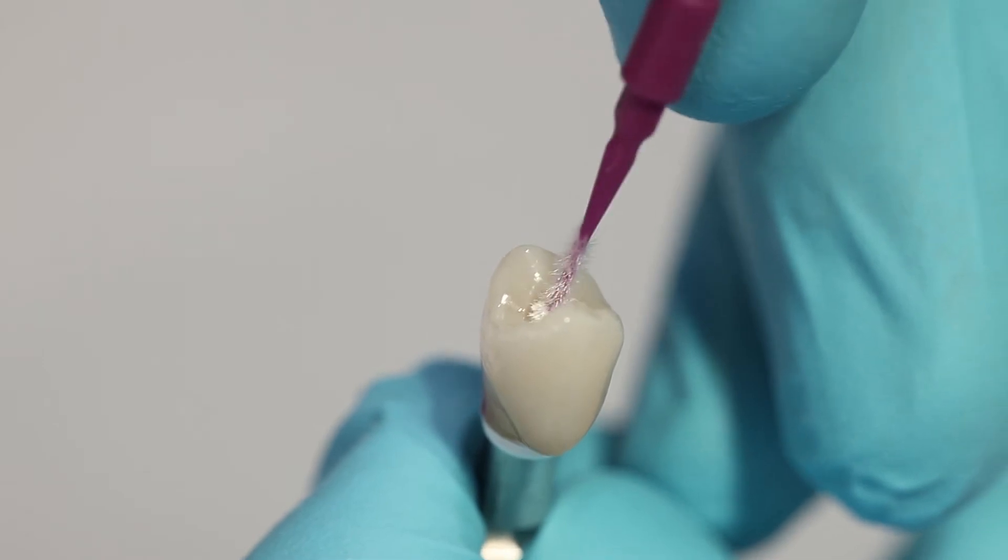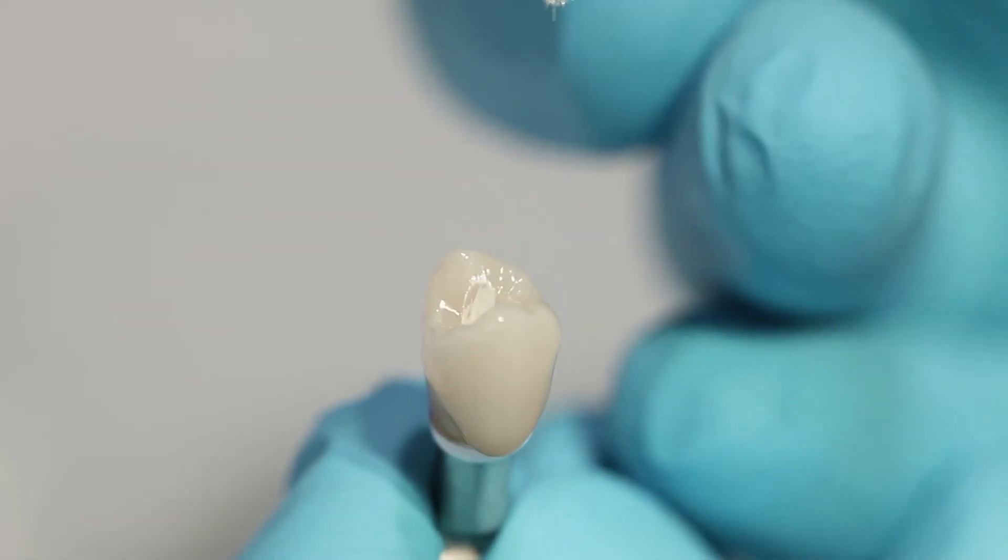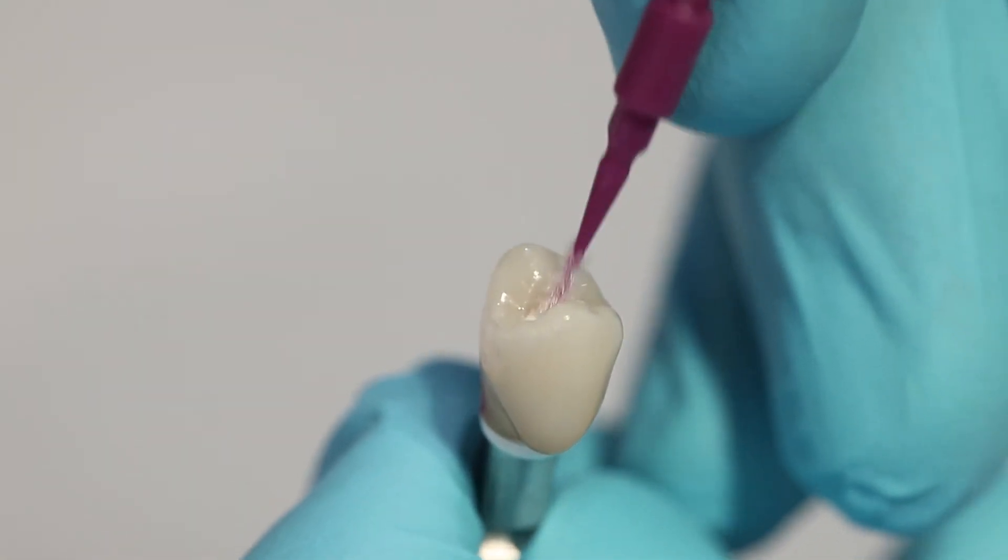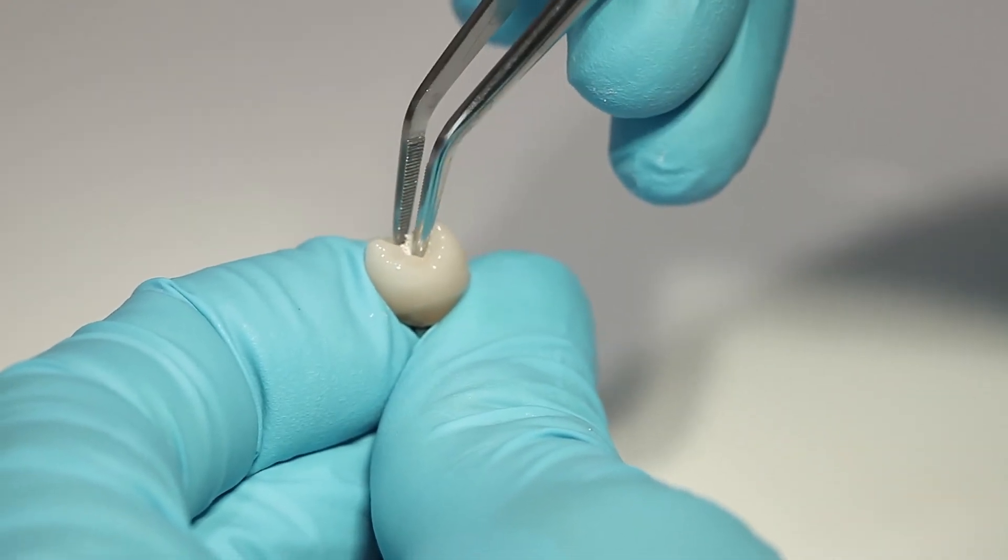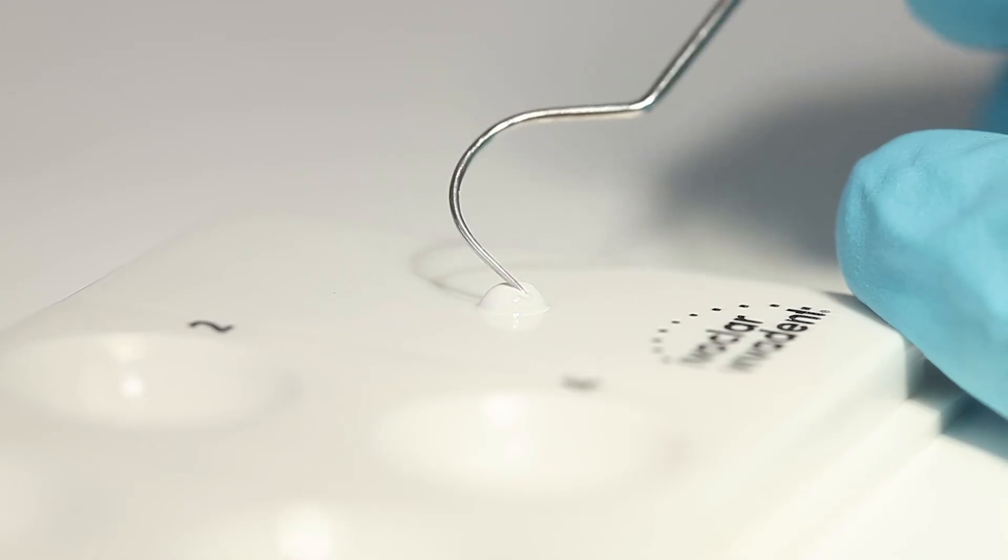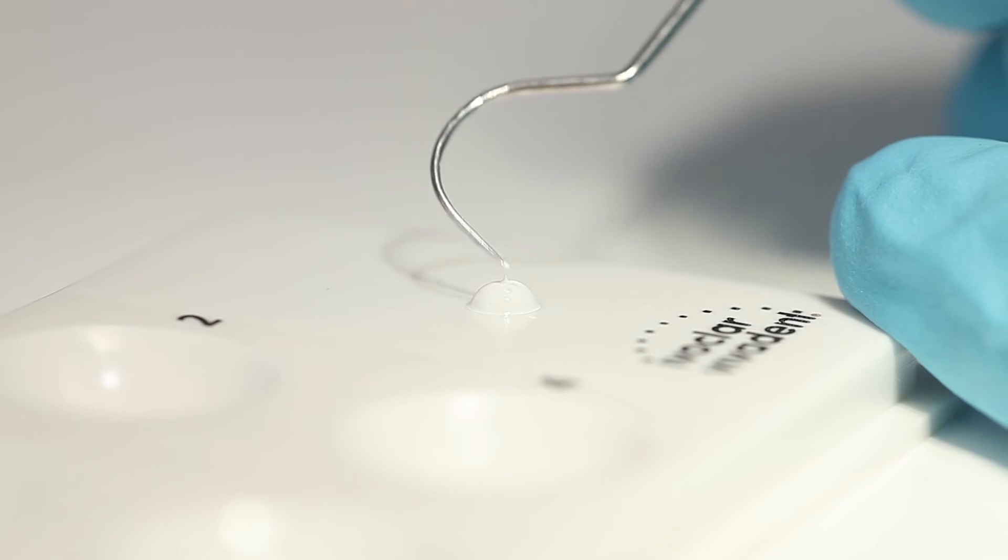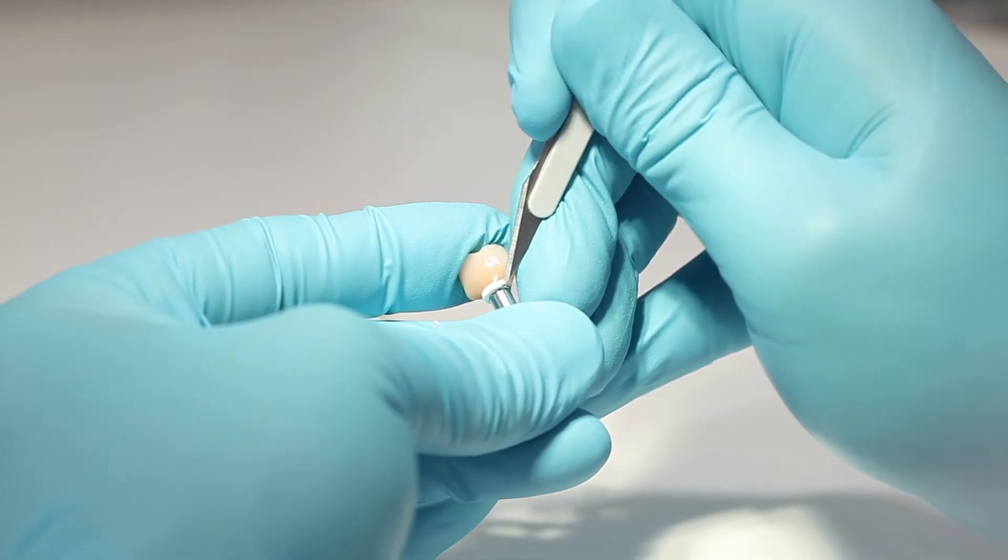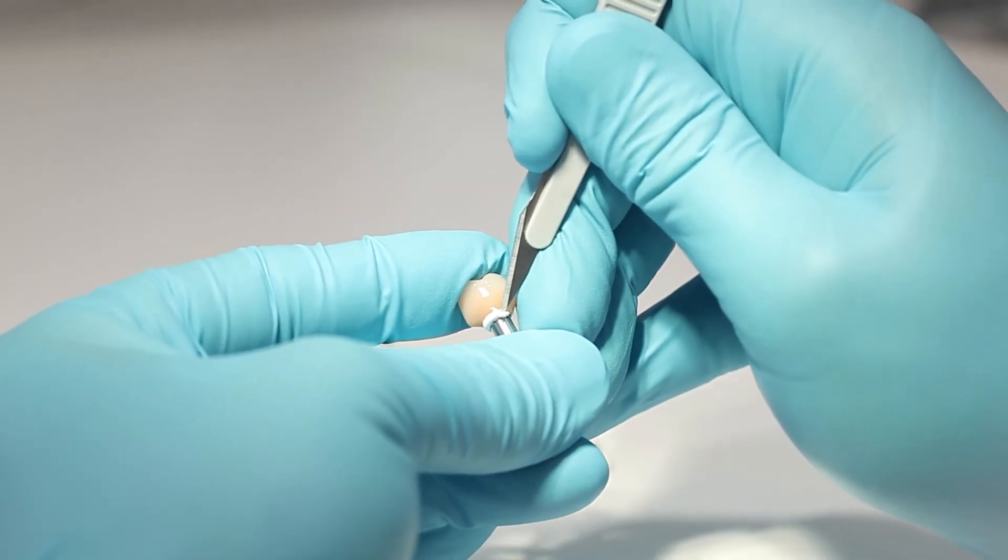Carefully remove excess multi-link hybrid abutment from the screw channel with a micro-brush or brush using rotary movements. Now carefully remove the foam pellet from the screw channel. Remove circumferential excess cement only after the initial setting phase, which is 2-3 minutes after mixing.